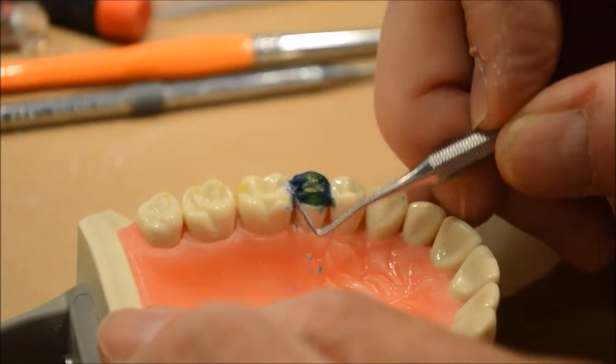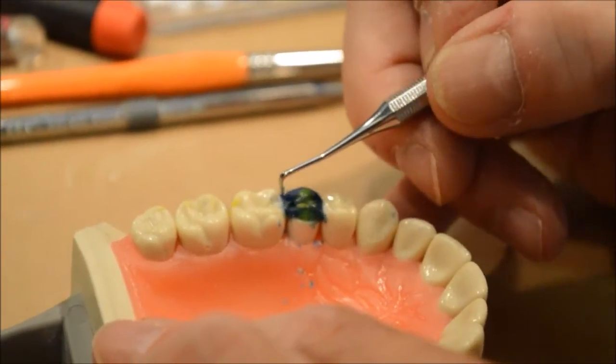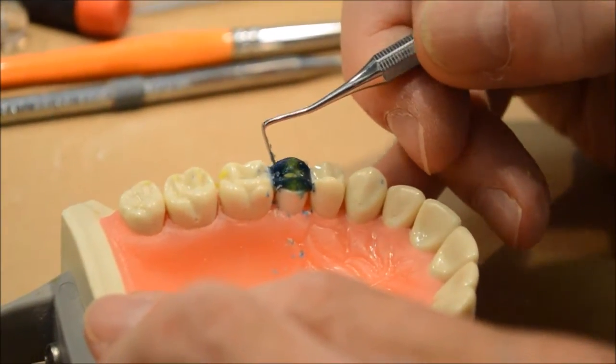I'm still working on my embrasures. Embrasures are the little v-shaped areas between the teeth that help to form the interproximal contact.